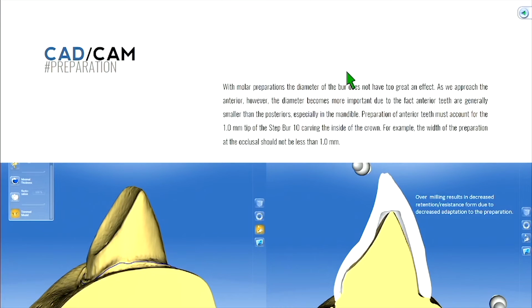The idea there is that that's sort of a minimally acceptable level at which that crown would fit. If you did the wax pattern or even a pressed ceramic the traditional way, where you press it or cast it, those crowns are much better adapted to that preparation. So when you put, let's say, just a gold crown that's been casted onto your die or your tooth, you get much less of that wiggle room there.